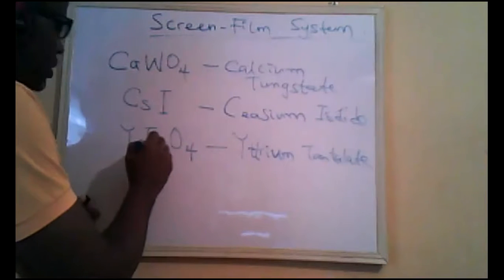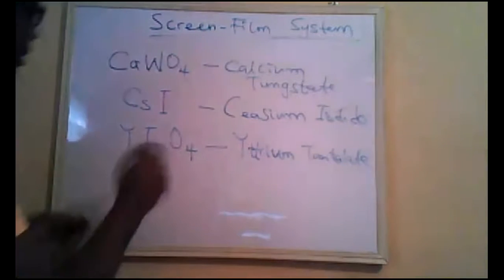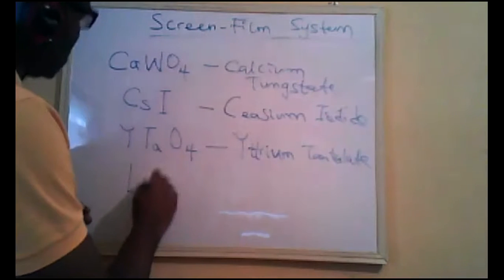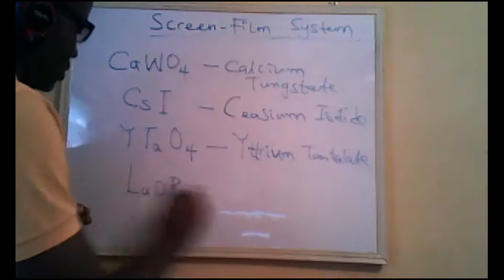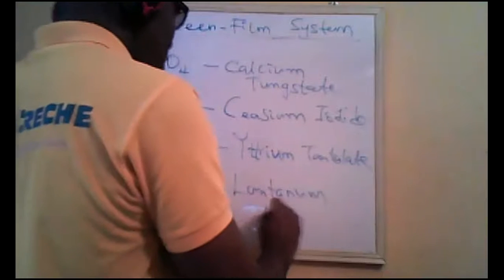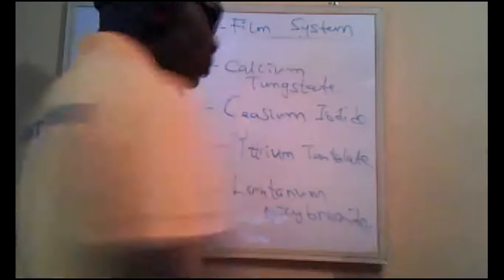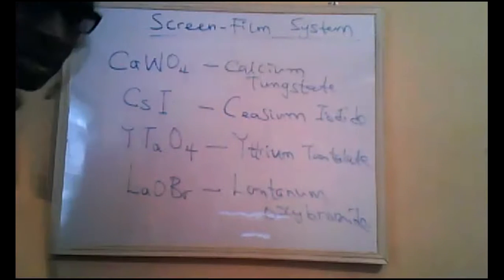Then we also have lanthanum oxybromide. It's also an example of one of the screens that we have. Lanthanum oxybromide.